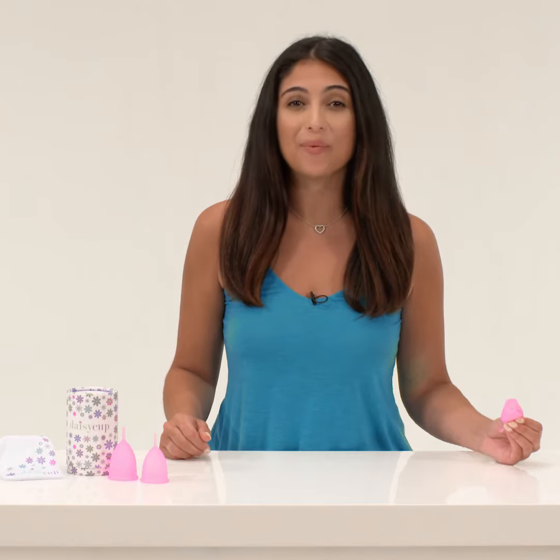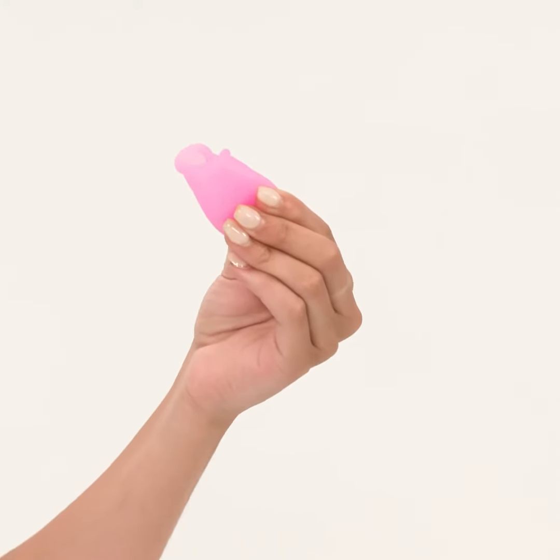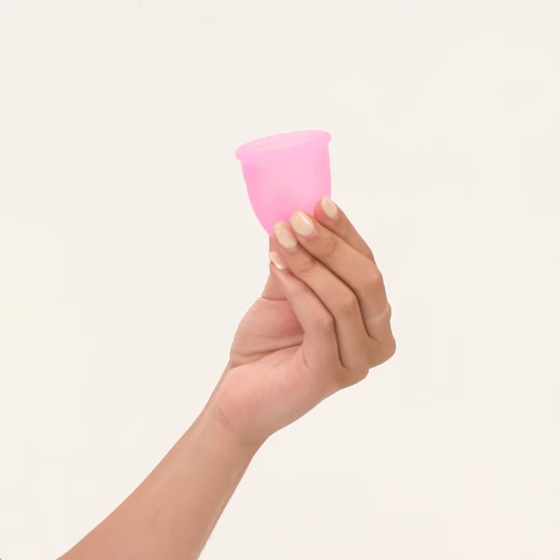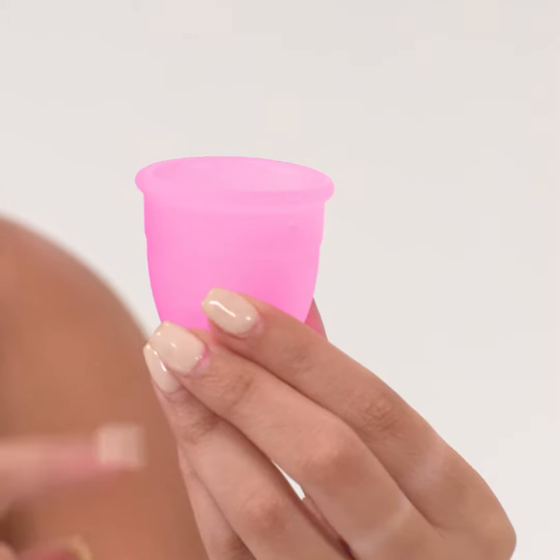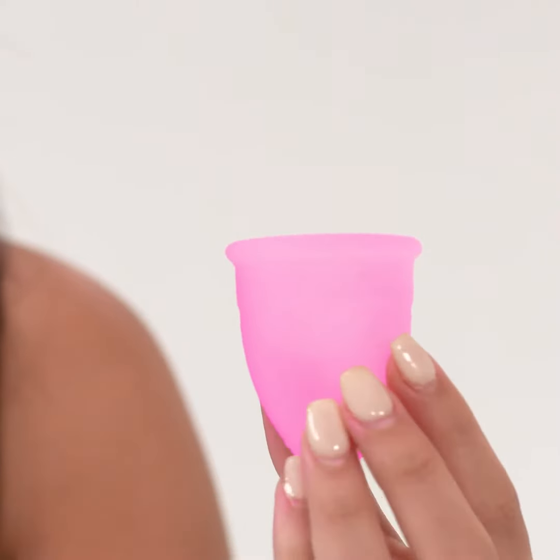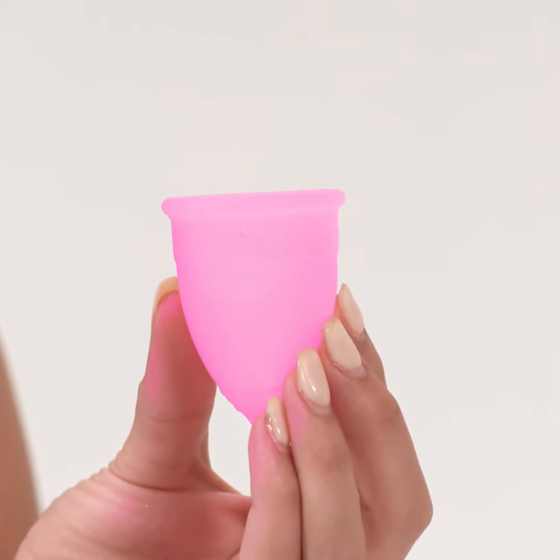Open your labia with one hand, and with the other hand, insert the cup at an angle, aiming for your tailbone. Once it's in, release the cup. Run your finger along the base to ensure it unfolded. Hold the base and gently rotate it to make sure it's snug. If you're having trouble inserting the cup, you can use a water-based lubricant.